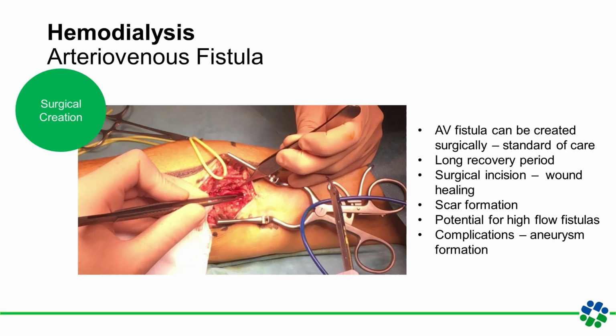However, it's important to note that there can be complications, such as the formation of an aneurysm, which is a bulging or weak area in the wall of the artery or the vein, and the development of narrow areas that can lead to inefficient dialysis or even clotting and failure. So it's important to always keep your eye on the ball and to feel your access, the soft purr or thrill, regardless of whether you have a fistula or graft. Any changes should be brought to the attention of your healthcare team, because that may warrant an intervention to help maintain or even salvage your access.